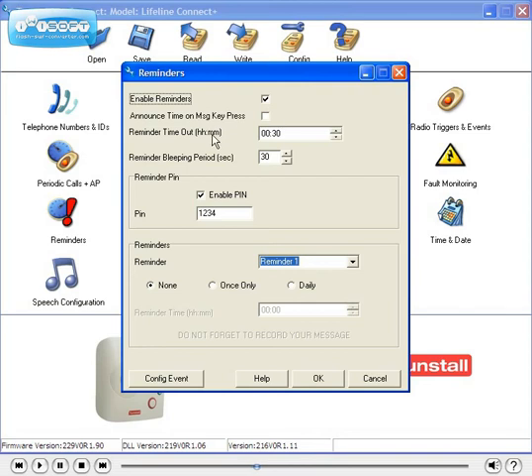The reminder timeout bleeping period is the length of time the unit will wait between bleeps.